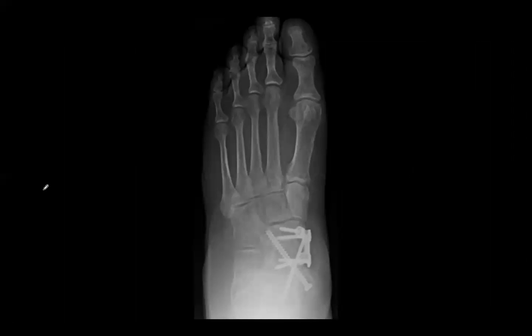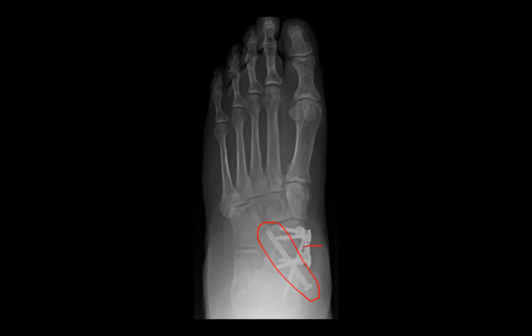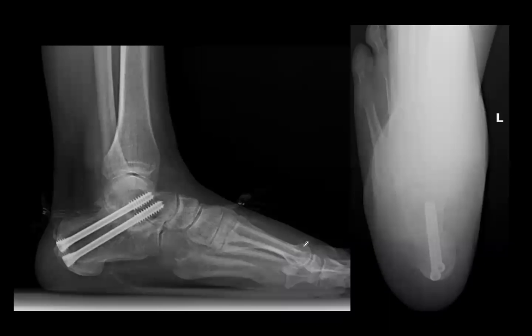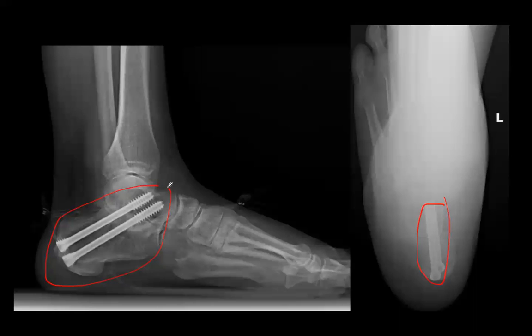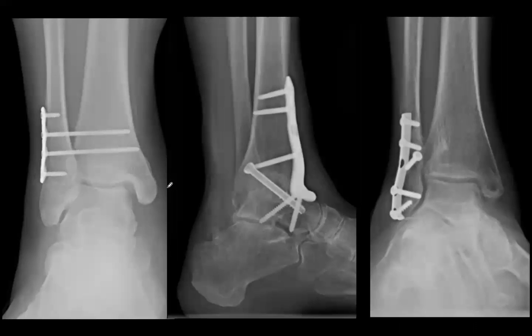At the mid-tarsal joint, a fully threaded 5.0 screw across the talonavicular is a positional screw — fully threaded and not lagged. Remaining plate screws are 4.0, with possibly a 3.5 for the compression screw. For the calcaneus, screws go from 5.0 for a calcaneal slide up to 6.5-8.0 for larger patients, with headless compression on the left and headed on the right in the examples shown.